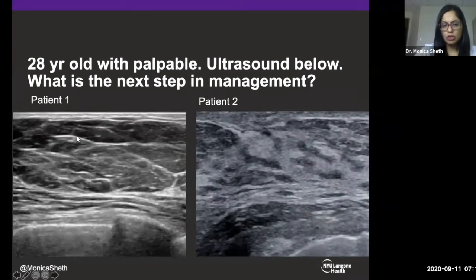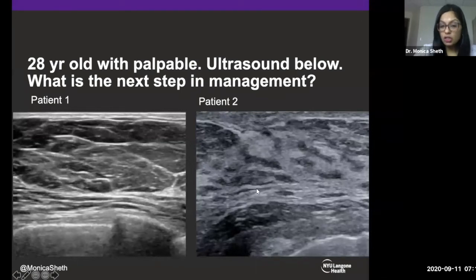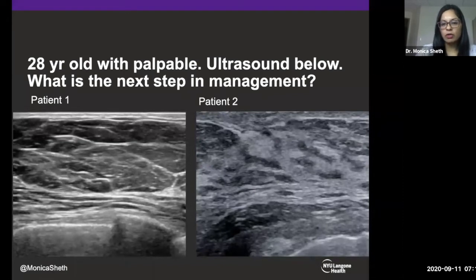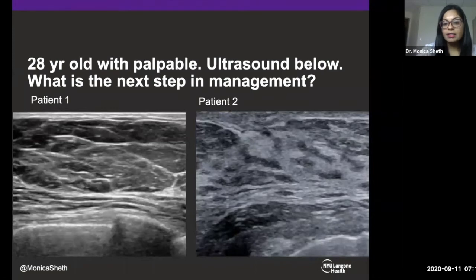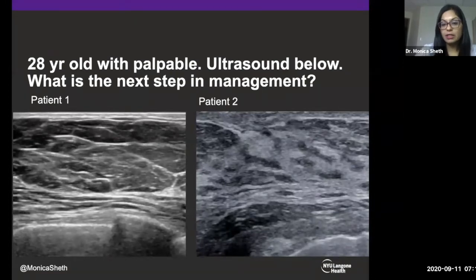Let's go over the findings. Patient one shows hypoechoic fat lobules — in breast tissue, fat is hypoechoic and glandular tissue is echogenic. Patient one has fatty breast tissue. Patient two has glandular, dense breast tissue. The next step in management depends on your level of suspicion. If patient one has fatty breast tissue and low clinical suspicion, offer reassurance — BI-RADS 1, follow up with her doctor. Patient two has dense breast tissue; if clinical suspicion is high, recommend getting a mammogram to look for microcalcifications or subtle distortion not easily seen on ultrasound.